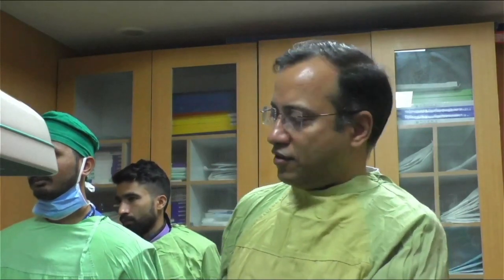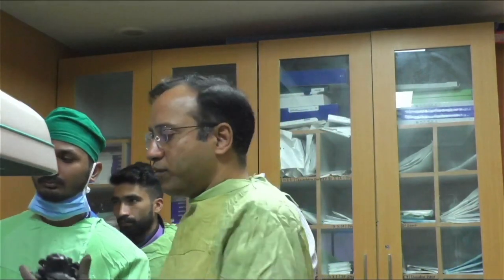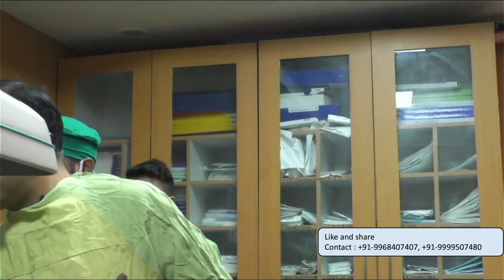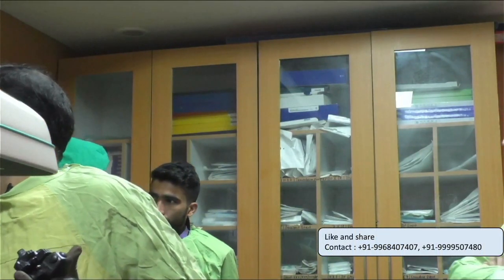Today we are going to demonstrate EUS and ERCP in a patient with chronic pancreatitis and pancreas divisum. This patient has been having recurrent episodes of abdominal pain for the last three years, so we are going to perform EUS.